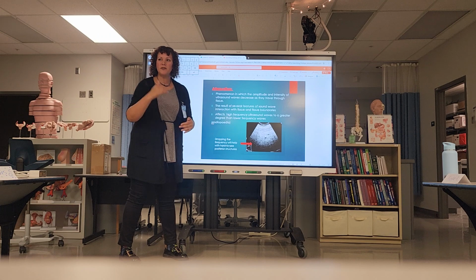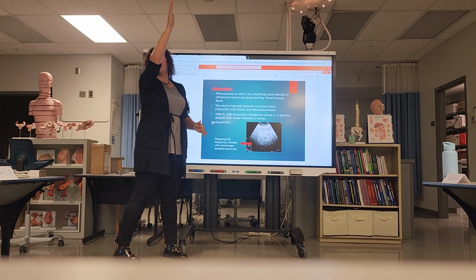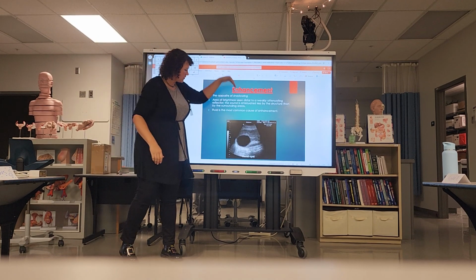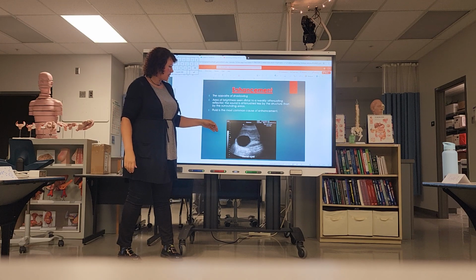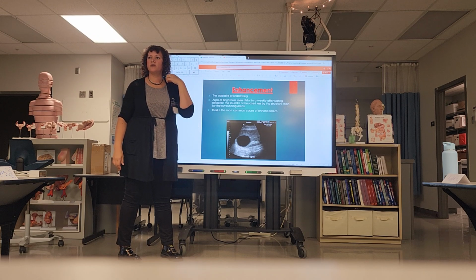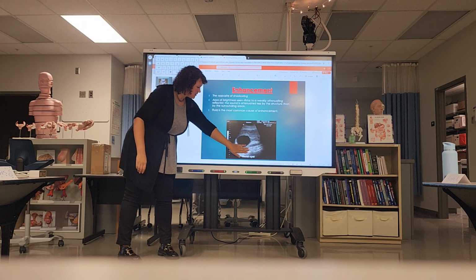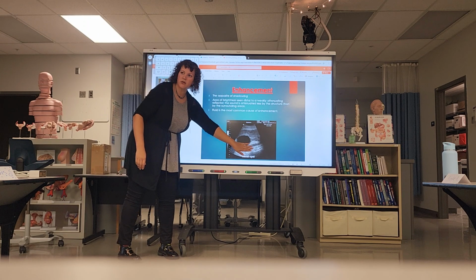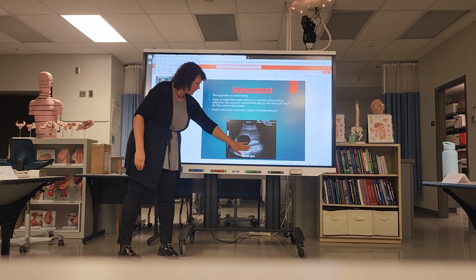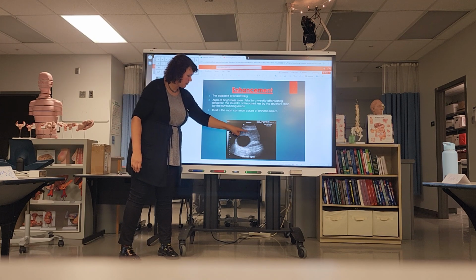The opposite of this is something not so dense, and the sound beams go right through. That's what happens with fluid. It's enhanced through transmission. It's the through transmission that's faster, and it creates this brightness just posterior to your fluid-filled structure. Does everybody see this? It's called enhancement.